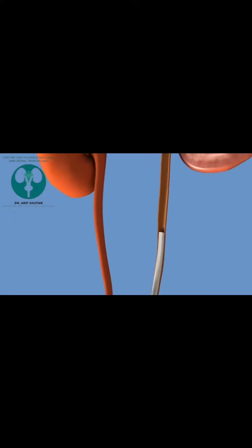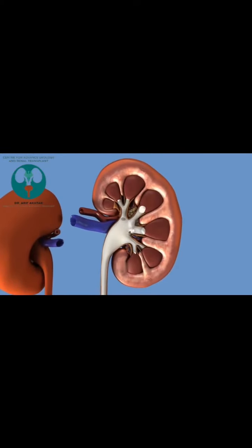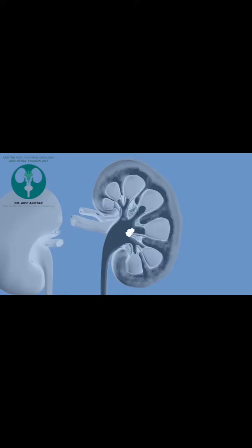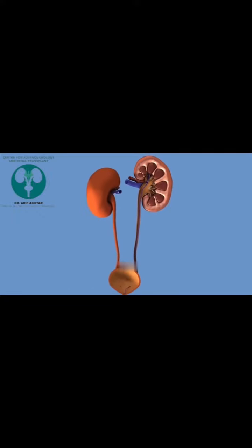A small tube is passed through the urethra into the bladder, and from there up into the ureter and into the kidney. A contrast study may be performed to assess the anatomy of the renal collecting system before stone removal. A contrast agent, or dye, is administered through the tube into the ureters. X-ray images clearly outline the urinary channel and exact position of the stone. A so-called safety wire that helps guide the ureteroscope through the ureter is inserted.